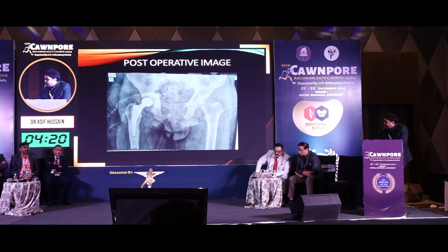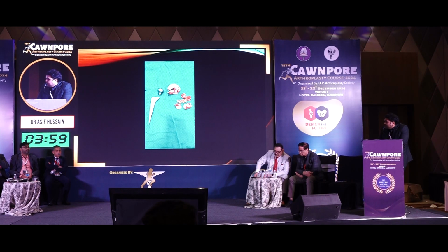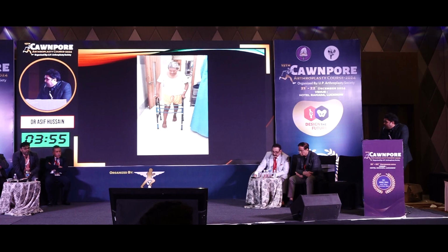This is my post-op X-ray. I made the version correction of the cup also. There was no infection, and I used the stem. I didn't remove all the cement. I used the cement as a restrictor and put the cemented stem. This is the second day of the patient post-op.